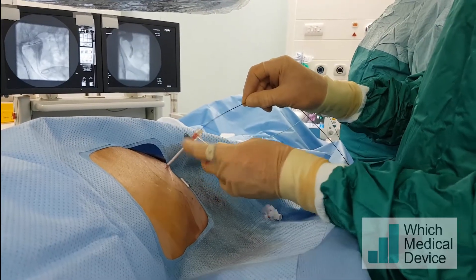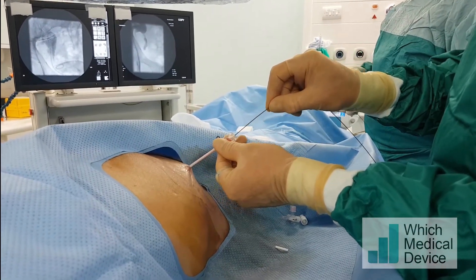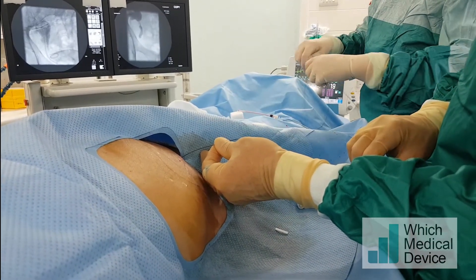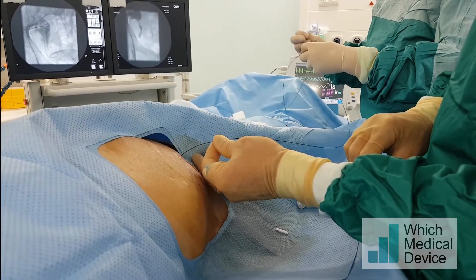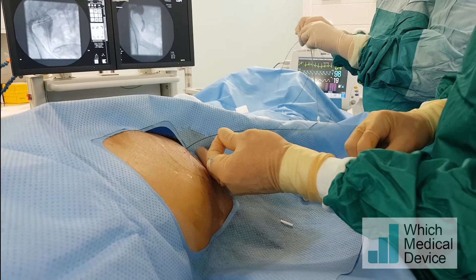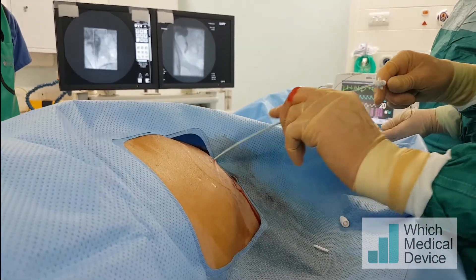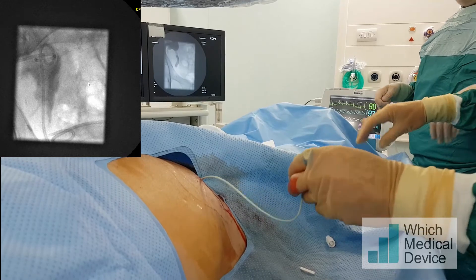Because this isn't a peel-away sheath, I'll have to remove it to place the nephrostomy — a peel-away would have been easier, but this gave us more support. So we're withdrawing the sheath over the wire and then placing a 7 French non-locking pigtail nephrostomy, which will be clamped off temporarily in case the ureteric stent doesn't work. If the creatinine stays improved and he's passing good quantities of urine, this nephrostomy can be removed on the ward with traction. Because it's not a locking nephrostomy, there's very little chance it will dislodge the stent. I'm pushing the pigtail into the collecting system, removing the guide wire — and that's it done.